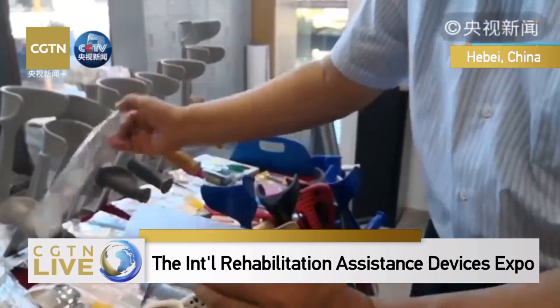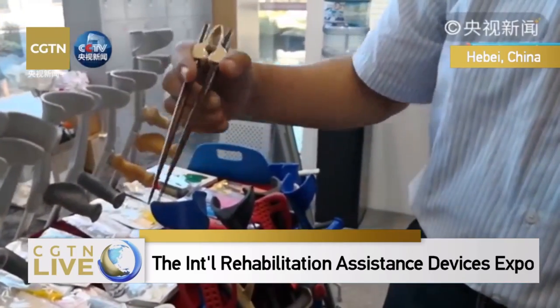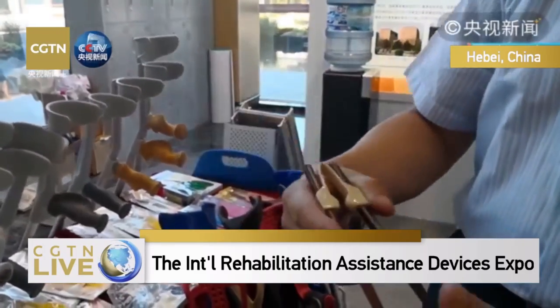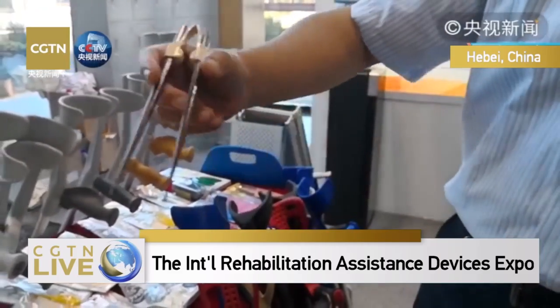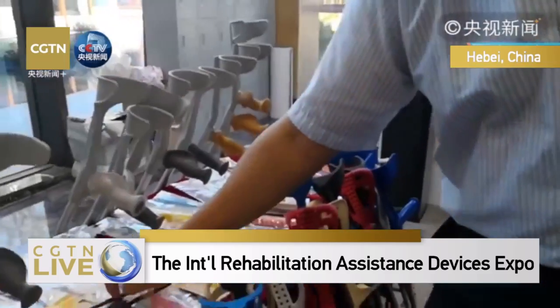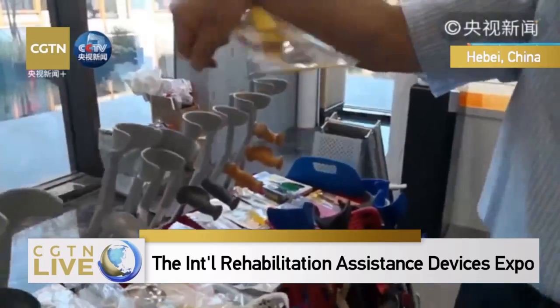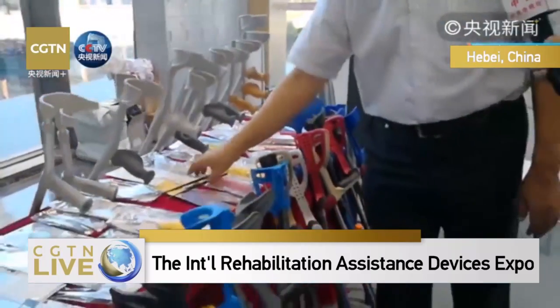These are chopsticks, a special design for elderly people. It's quite easy and handy to use. And we have also specially designed spoons.